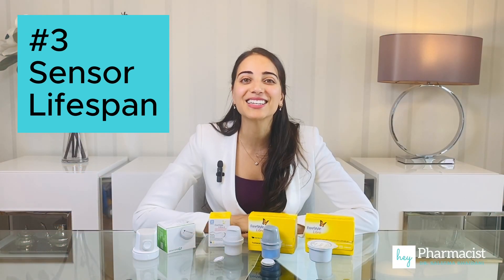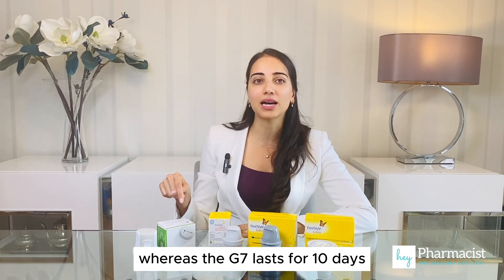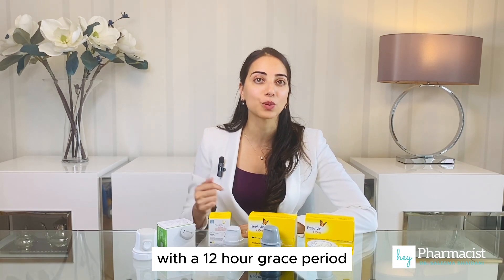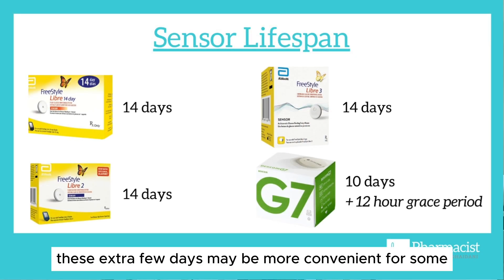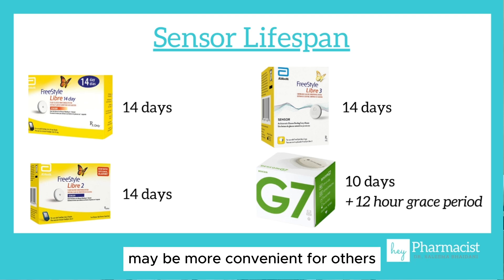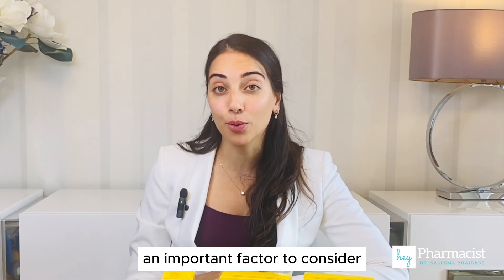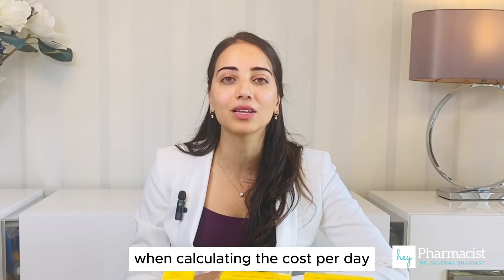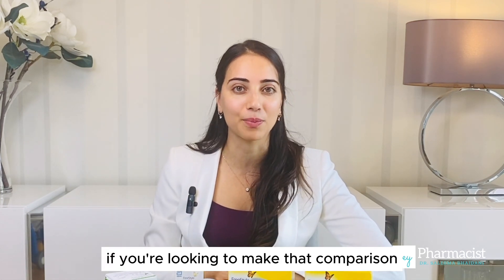Sensor lifespan is another important factor. All the Freestyle Libres have a lifespan of 14 days, whereas the G7 lasts for 10 days with a 12-hour grace period. So you do get a few extra days with the Libres. These extra few days may be more convenient for some, or having a grace period may be more convenient for others. The lifespan is also an important factor when calculating the cost per day for the sensors.